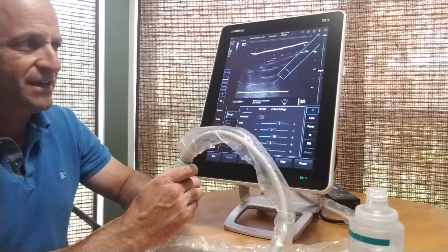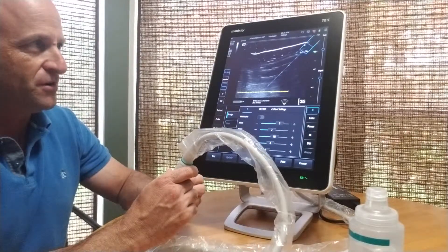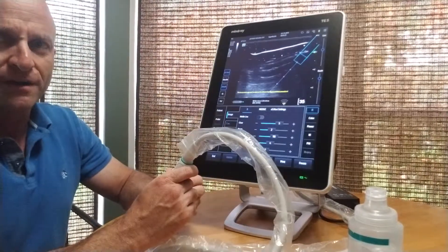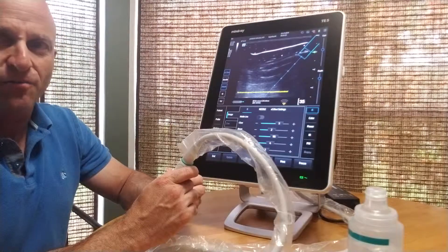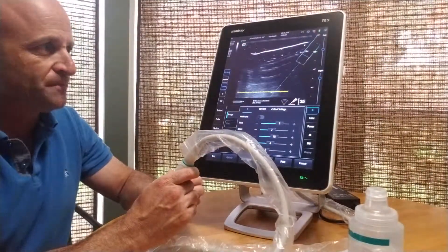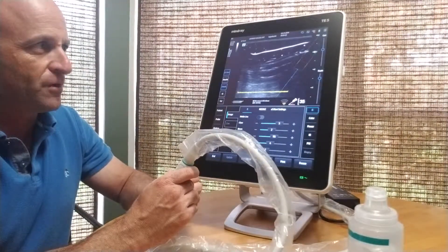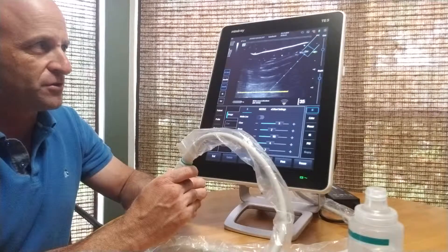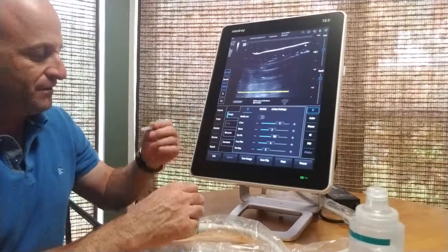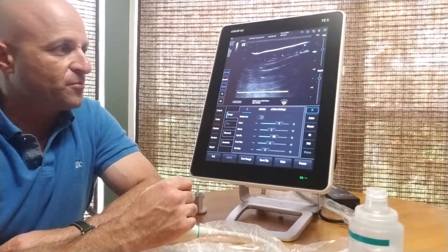That's something you can see without having to worry about visualizing the needle, because you know the depth and the orientation that the needle approach is coming at. This has very high quality needle visualization, but when you go into deeper structures, from a simplicity perspective — especially if you're just learning — you want to make sure you're getting the right approach and the right angle. The e-spatial navi feature definitely helps simplify that part of the process.